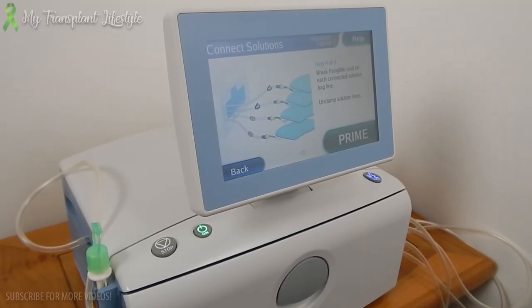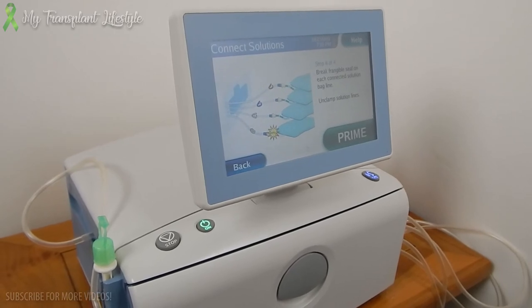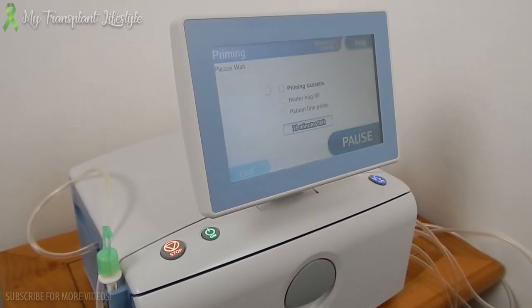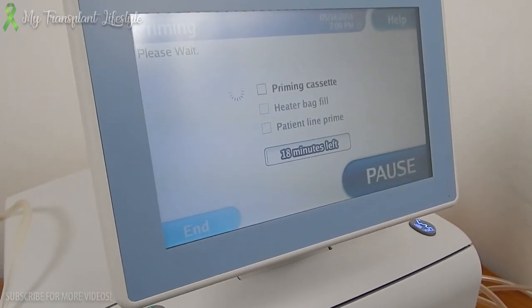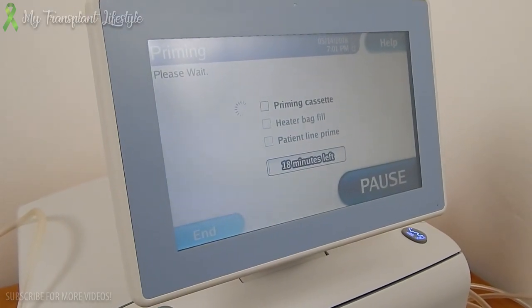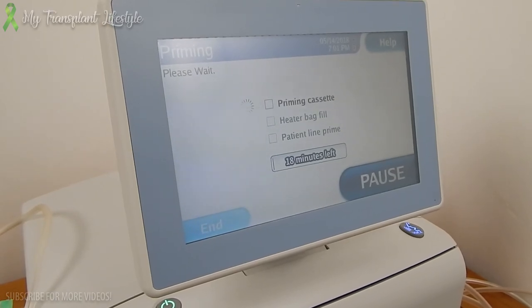Now that everything is set up, connected, and ready to go, it's time to prime the system. The system is priming. Please wait. There's three steps in priming: priming the cassette, the heater bag fill, and also the patient line.